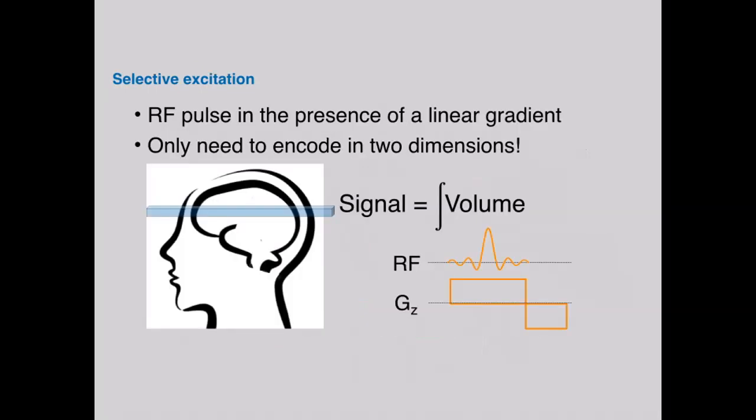Now, what is selective excitation? Well, selective excitation is you apply an RF that has a limited bandwidth, okay? So it has a certain bandwidth.